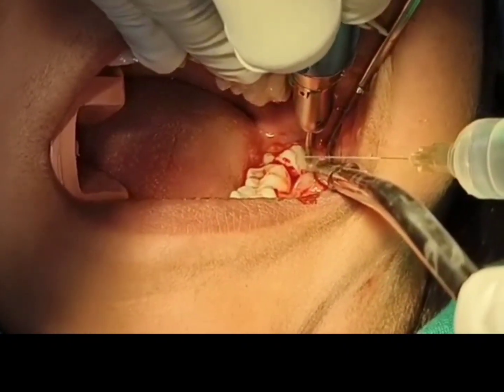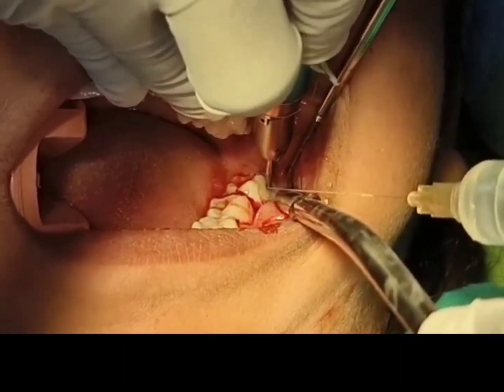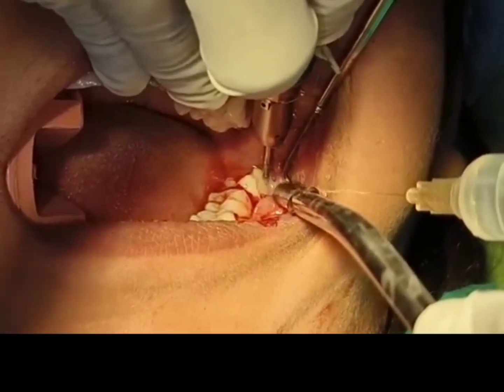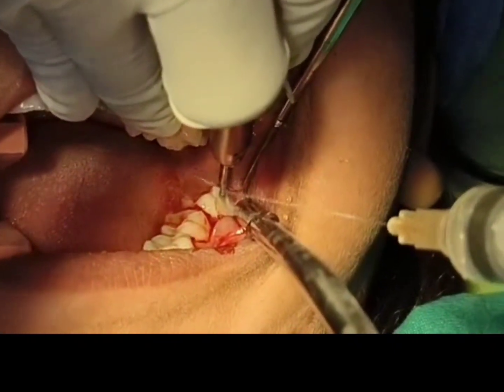If we continue without creating adequate distobuccal space for luxation of this third molar, we may end up fracturing the angle of the mandible with undue forces.